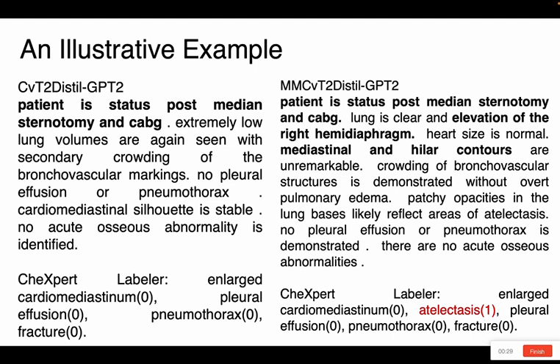These are the generated findings using the baseline method CvT2DistilGPT-2 and our proposed Multimodal CvT2DistilGPT-2. Our multimodal method comments on a clinical observation of atelectasis as requested in the indication.